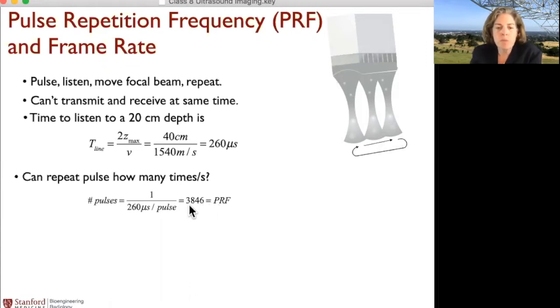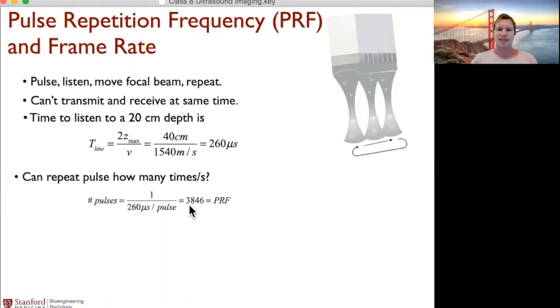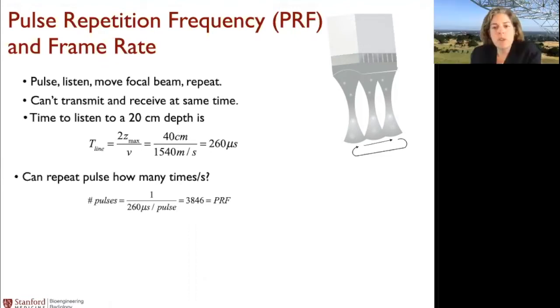I have a question. Is this restriction of time really because the transducer will naturally move from the technician? If the transducer were perfectly still, would time be an issue? Well, you assume that the transducer is still. So when you translate over which subaperture you're listening to, that's just done electronically. There's no movement at all.